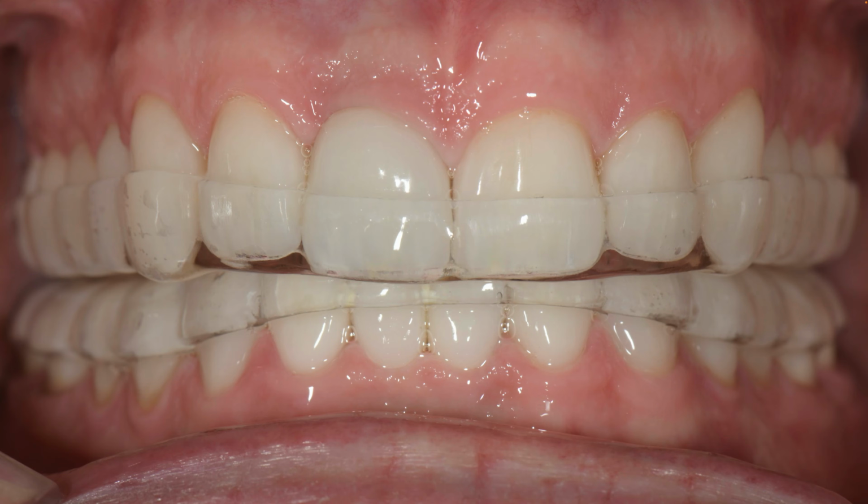And we protected this with an E-splint. So an E-splint is basically an upper and lower acrylic splint with a ramp at the anterior so the back teeth don't touch. So the patient can grind around and they really only touch the ramp and they're grinding around on the ramp. So it's like a permanent deprogrammer, but you don't want to leave the back teeth uncovered. So we have them all covered so nothing will move. And then the anterior is just this deprogrammer.